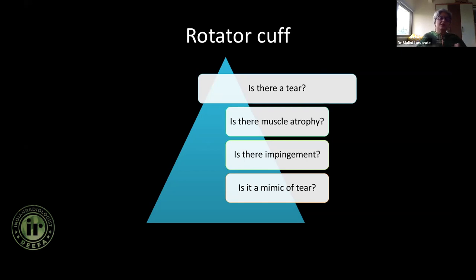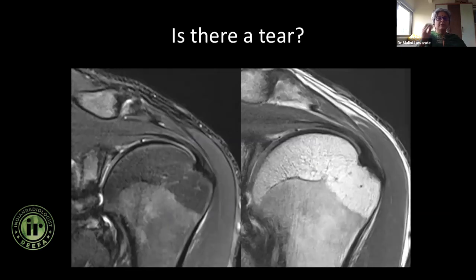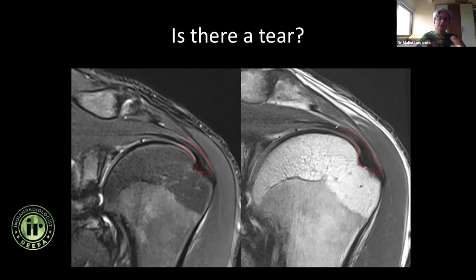MRI can answer more questions. The first question we want to answer is: is there a tear or not? This is how a normal tendon looks on all sequences — it is hypointense. This is because there are no mobile water protons; the hydrogen protons are tightly bound in the collagen fibers, they are not moving around, they are not giving any signal, so it looks dark.